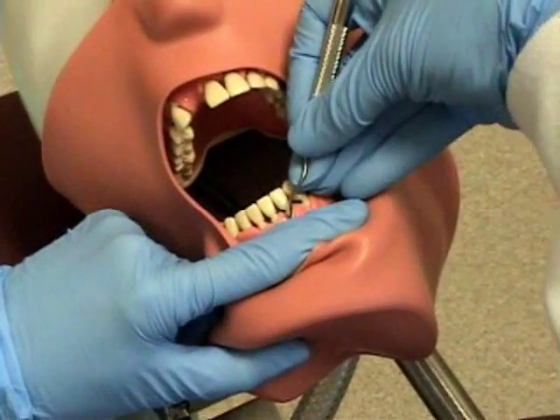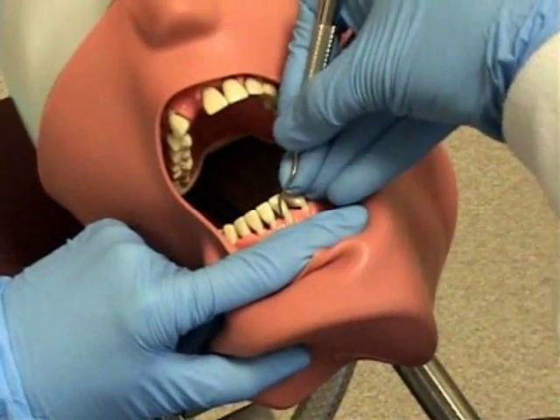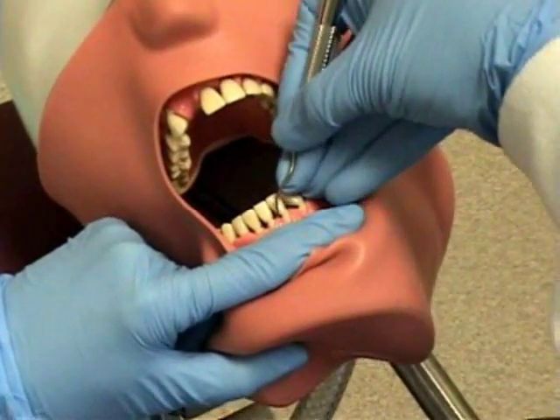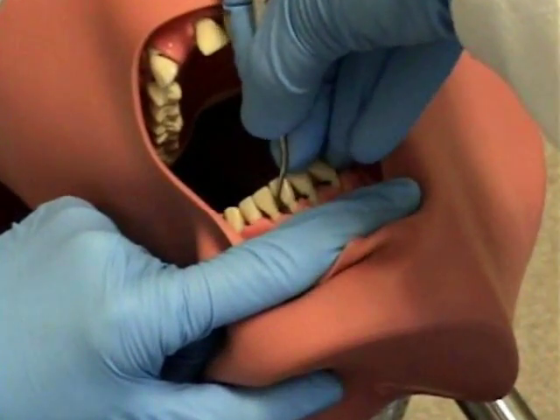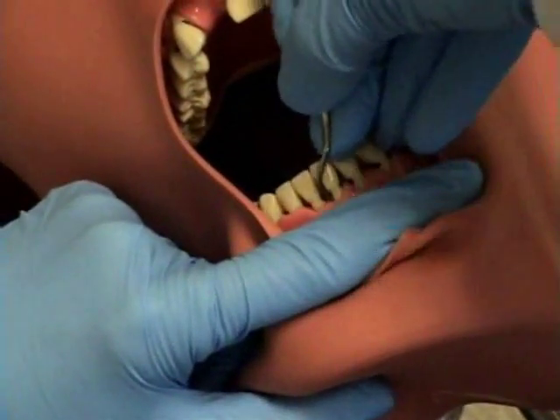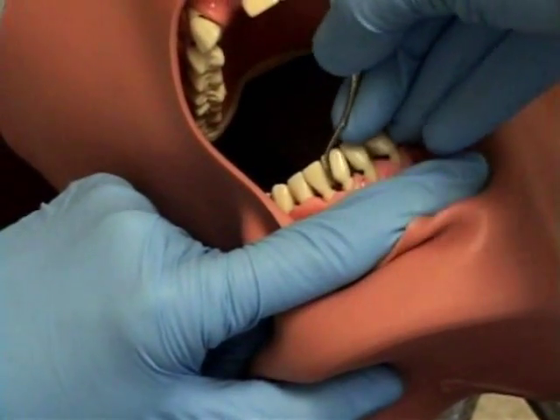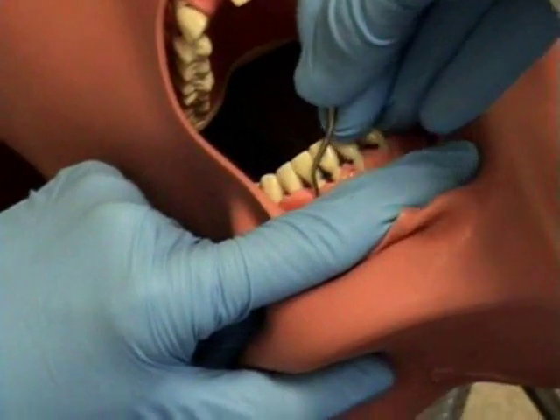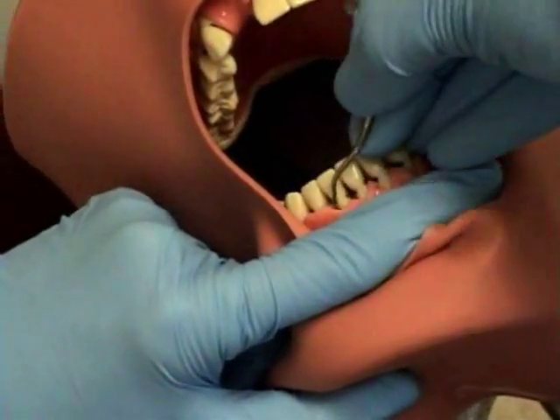Ms. Johnson is now sitting at 8 o'clock, and you can see the adaptation of a closed blade being inserted into the sulcus, opening so that the terminal shank is parallel to the long axis, the grasp is tightened, and the instrument is activated. This works well with patients that have recession.